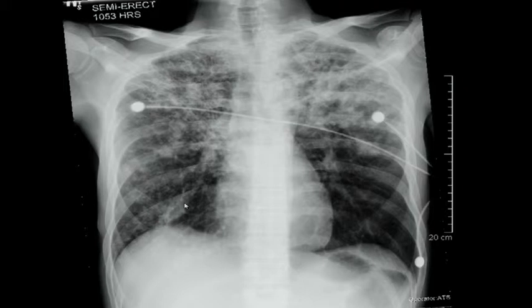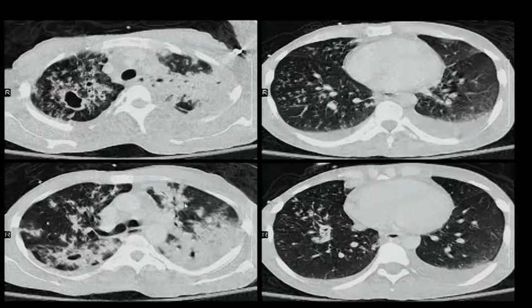Good. So you said there were alveolar opacities, there were reticular opacities, there were some cysts, there was upper lobe predominance, and I added that there was a juxtaphrenic peak, so there was loss of volume of the upper lobes. Anything else? There might be some bronchiectasis. I think that both hila are kind of elevated. Correct, because of traction. That is the same thing that is said in the juxtaphrenic peak. Traction, both hila elevated. Okay, very good. Keep going.